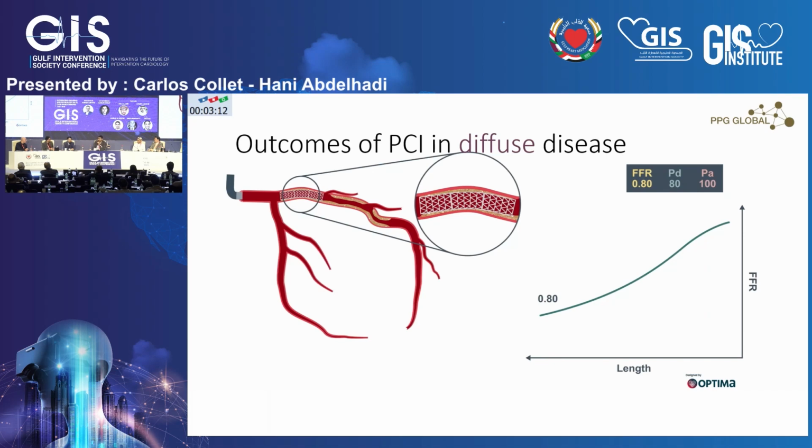Yes. And I think, to be honest, I congratulate you on picking up the case. I think many places will just call it a HFpEF. That's it. So this is actually a non-coronary case. This is just HFpEF. Let's give some Lasix and discharge the patient without actually doing the IFR and FFR for the case. Anything from you?